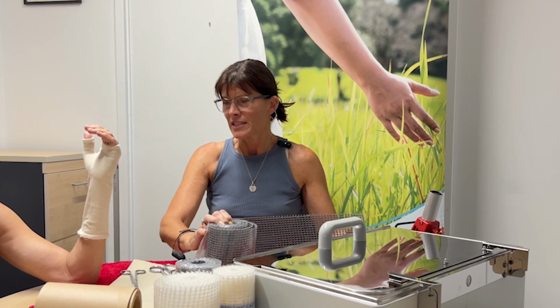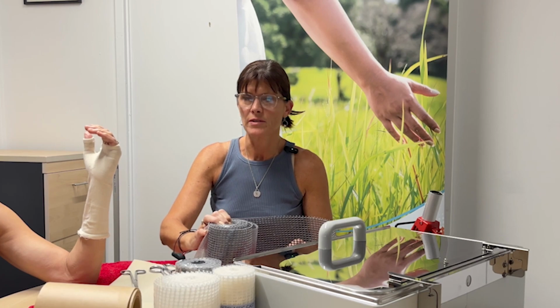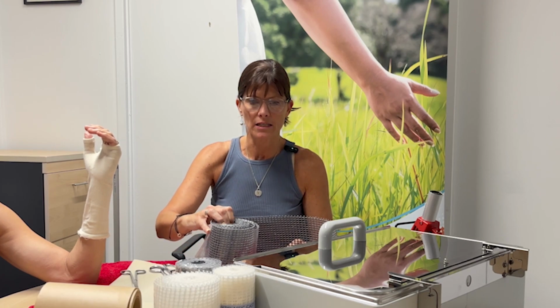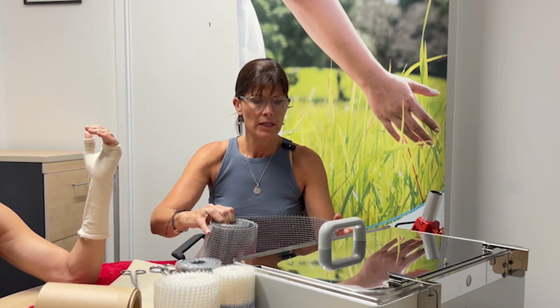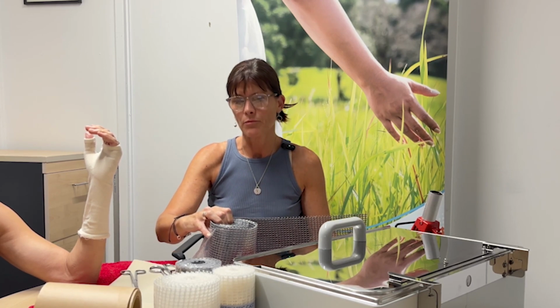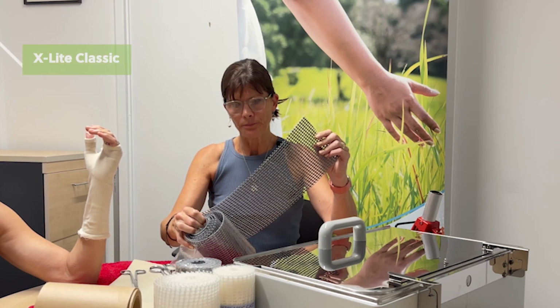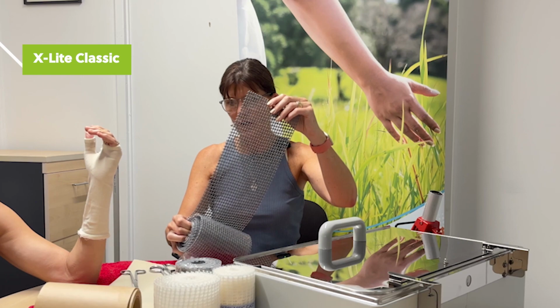As you know, with a flexor tendon repair, you have to be in the splint full time for 6 weeks. So if the splint is hot and heavy, that's a big ask, and lots of patients end up taking them off. If you can make something that's really lightweight and comfortable and ventilated, they're more likely to be compliant with splint use. So I'm going to use the classic, which is the one with the large wide weave.